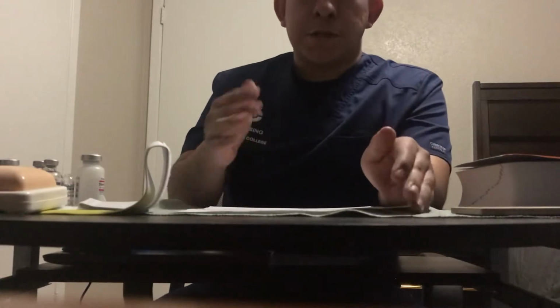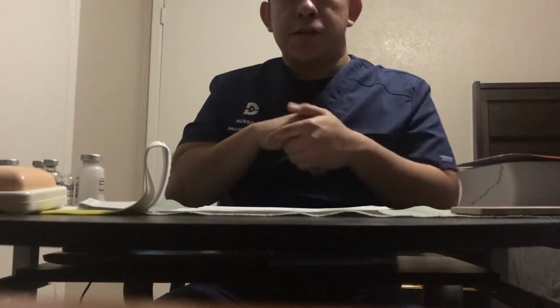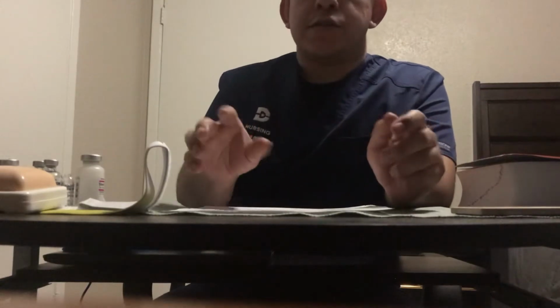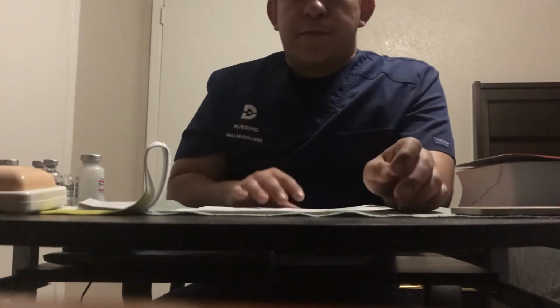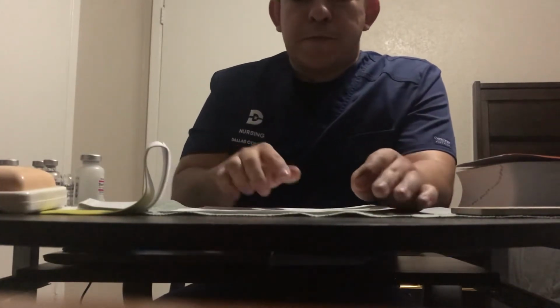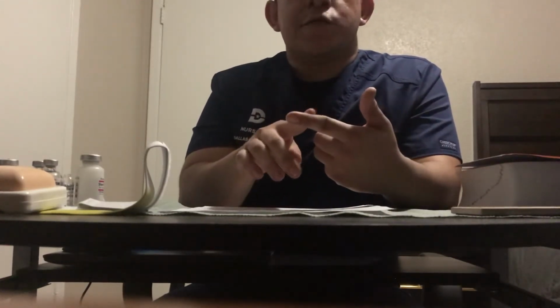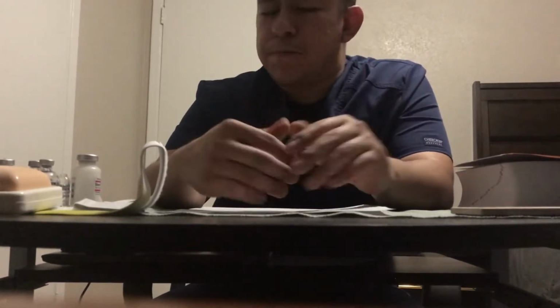So now that I know what I need, I'm going to go to the medication room, and in the room I'm going to wash my hands, do my hand hygiene for 30 seconds, make sure that the area that I'm going to be preparing my meds on is clean, and then start pulling my meds. As I pull my meds from the Pyxis, I'll be doing my first medication check, which is where we check for the 6 rights. We check for right patient, right medication, right route, right dose, right time, and proper documentation at the end.